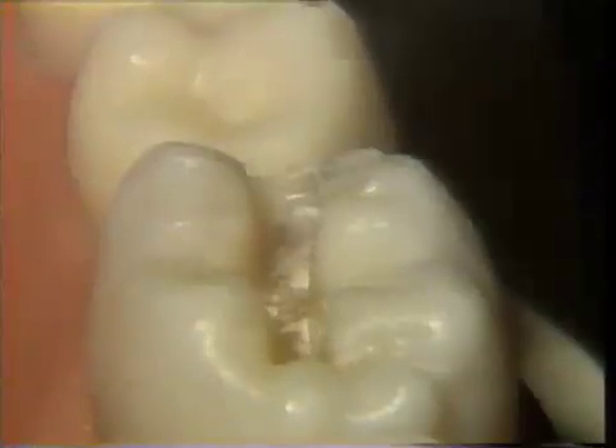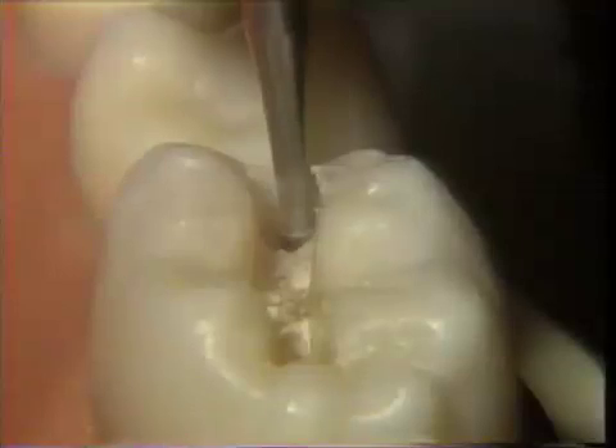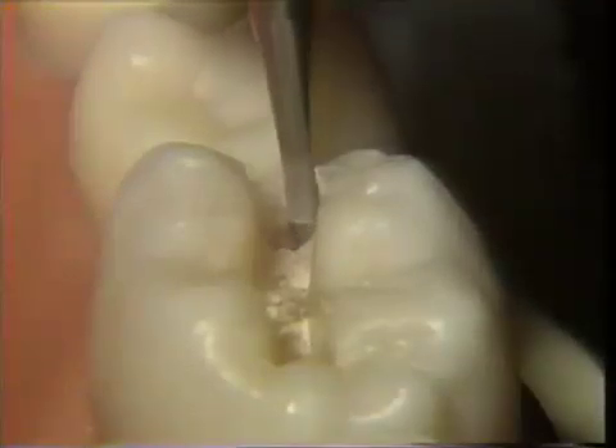After completing the buccal extension, the burr is placed back into the original depth of penetration, and the identical movements are carried out in a lingual direction until the desired extension is reached.